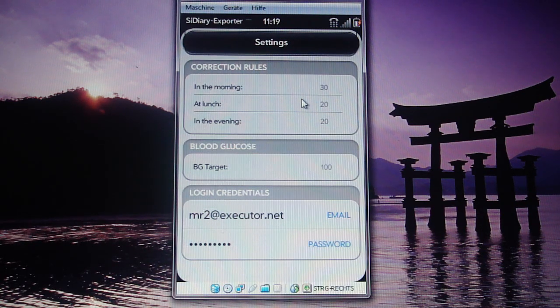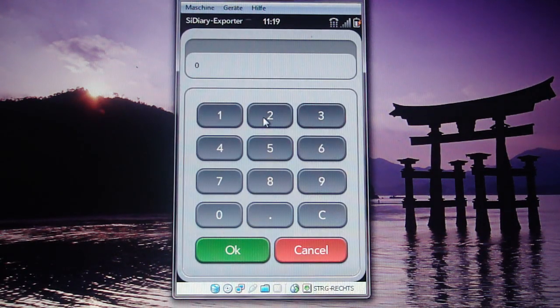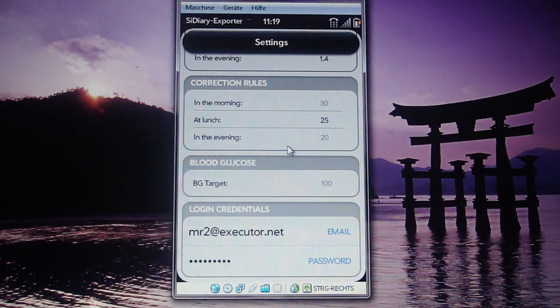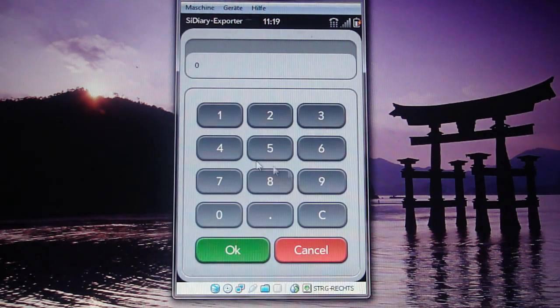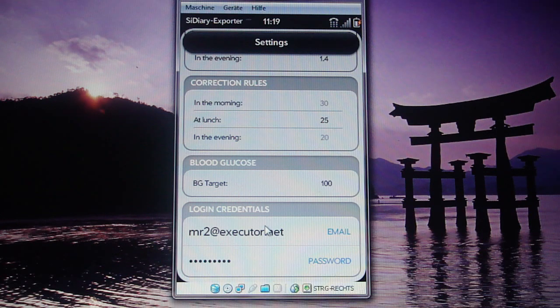You enter these values for morning, lunch, and evening as well — just click on the number, change the value, and it's saved. Next is your blood sugar target, which is 100 for most people. Then come the login credentials for your SiDiary account.